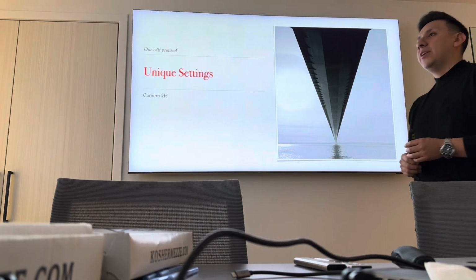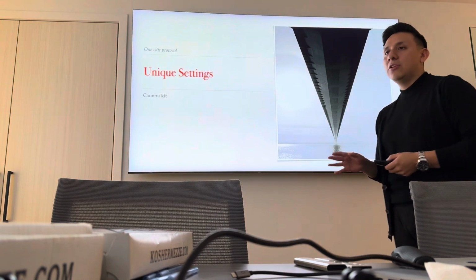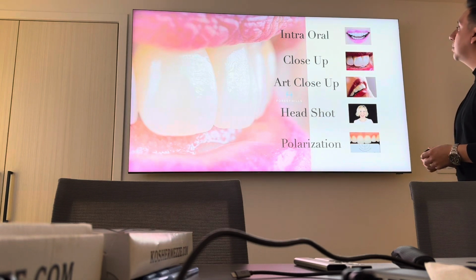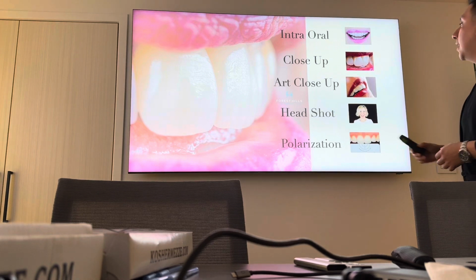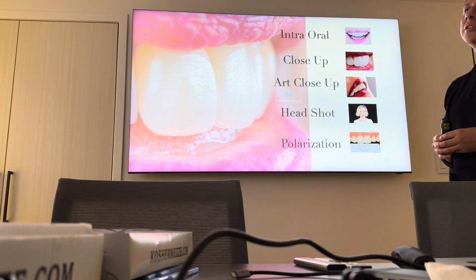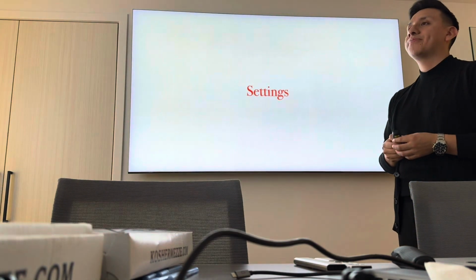Once again, I created just one edited protocol, unique settings, and one camera kit. With all of this, you're going to be able to take all these kinds of pictures. We can take intraoral pictures, we can take close-ups, okay? We can take artistic pictures. You can also take headshots of the patient's face, extraoral pictures, and for fun, you can take polarization, so you can send all this work to your lab technicians.